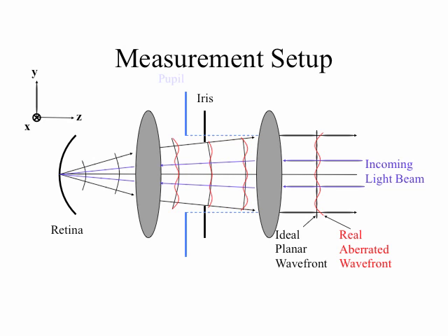Well, the rays of light are converging to the left. That means that the sign of the vergence has to be minus. And 1,000th of a meter means that it is 1,000 diopters. So at that point, we're at minus 1,000 diopters, minus 1,000 for the vergence.